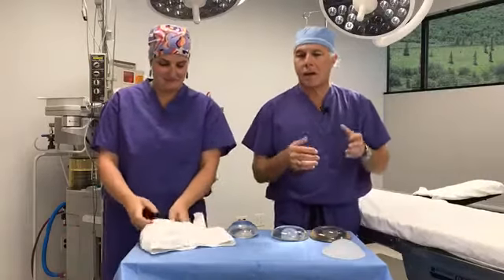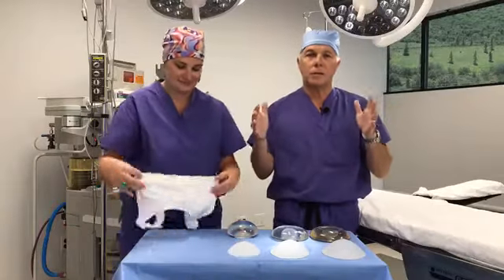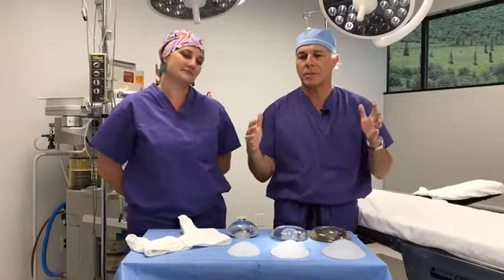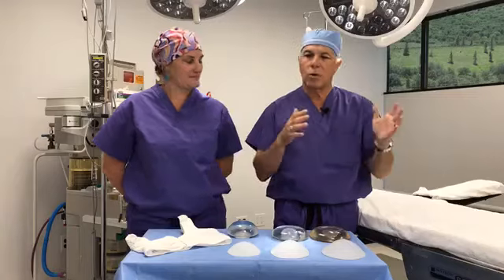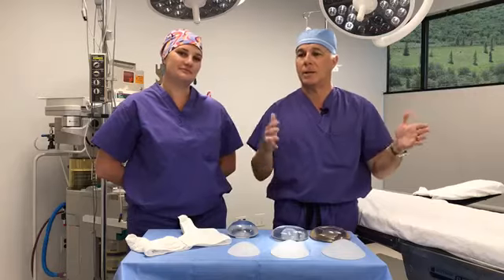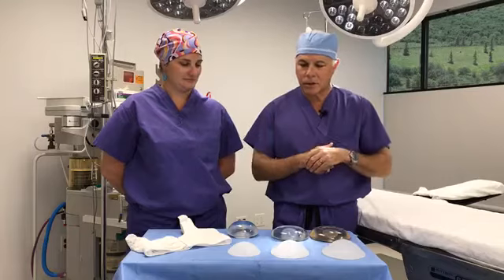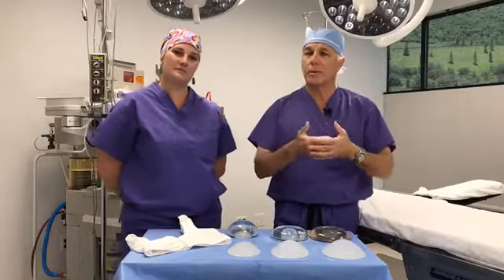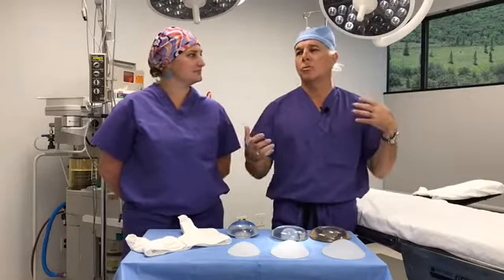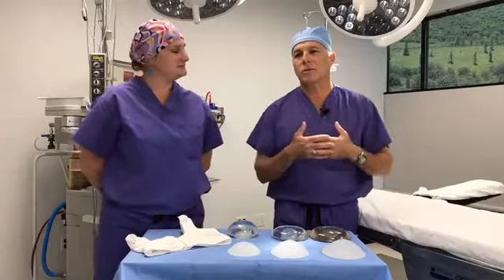So we start out, Lindsay and I frame for the patient a ballpark range of implant sizes that we think we could make fit and have a natural looking shape and size. And then we work with the patient to help figure out, within that range, the highest number we think we could put in and the lowest, and where that patient wants to be. The patients try on implants and look in the mirror and try to get a feel for what size looks desirable for them based on their shoulders, their height, their hip width, their waist, and try to come up with what's too big.